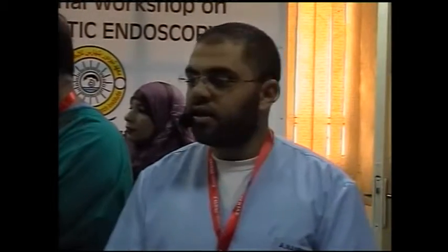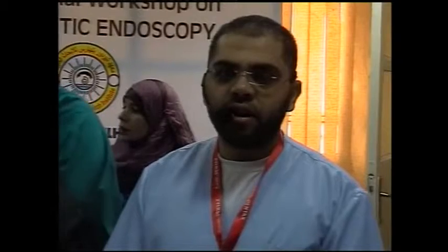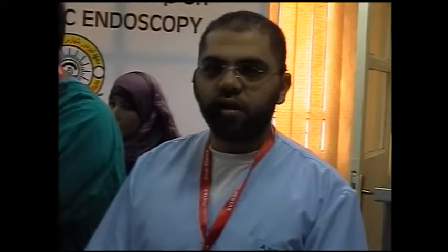Hello, everybody. This is a 20-year-old female patient presenting with abdominal pain, vomiting, and low-grade fever for one month. Upper endoscopy revealed a duodenal ulcer with necrotic floor. Biopsies revealed duodenitis. Ultrasound revealed multiple abdominal lymphadenopathy. Her CBC, liver, and kidney functions were all normal. Her ESR is not even so elevated.